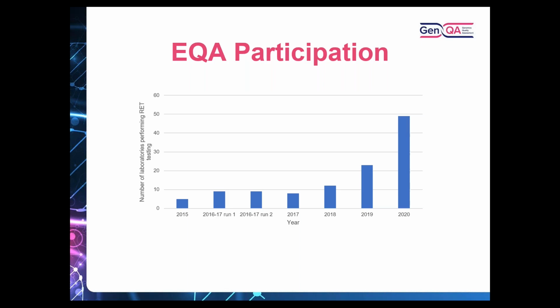And you can see there's been quite a dramatic increase when we introduced RET testing as part of our lung cancer EQA between 2019 and 2020. And that's also in a large part due to the testing performed by the laboratories, which is summarised in the following slide.